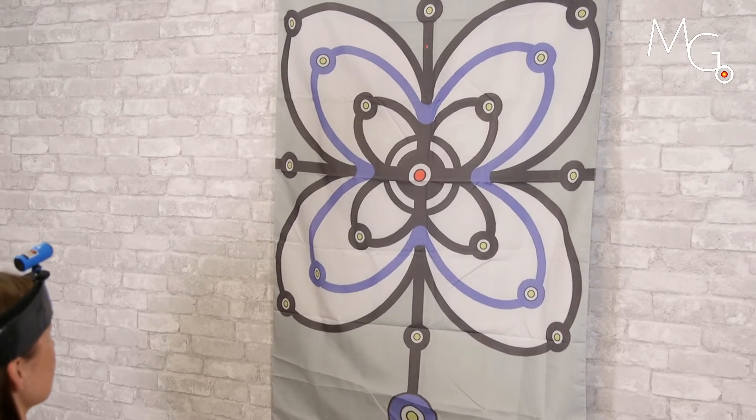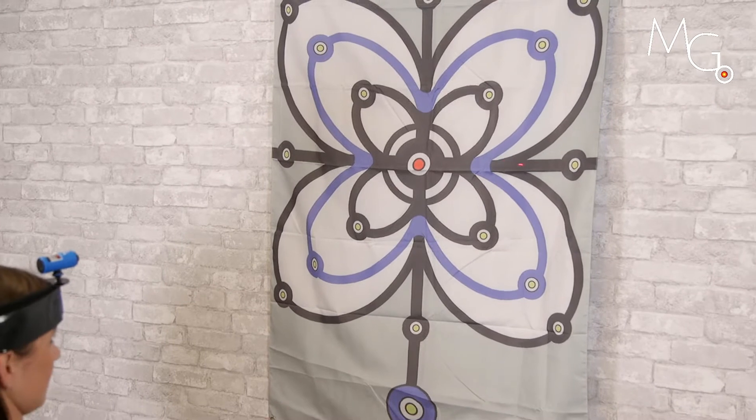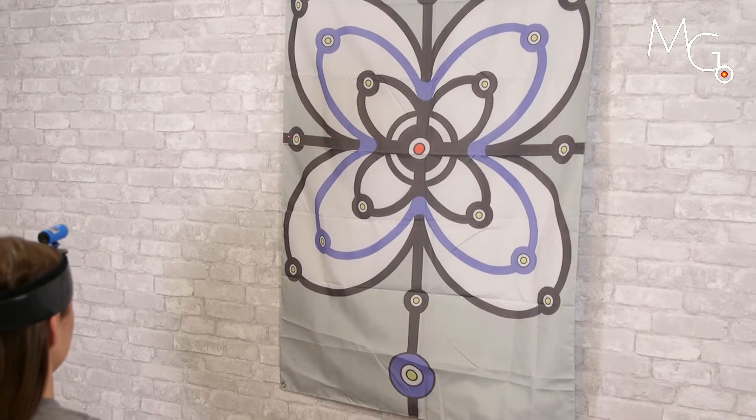You can also do rotation, right and left.